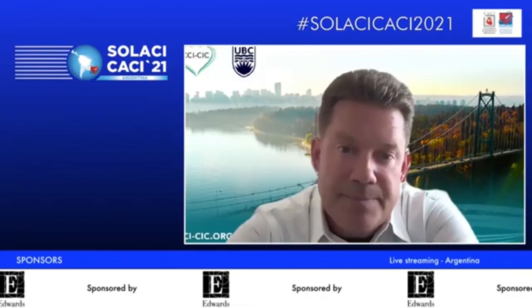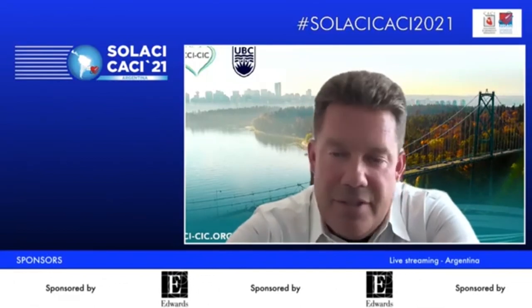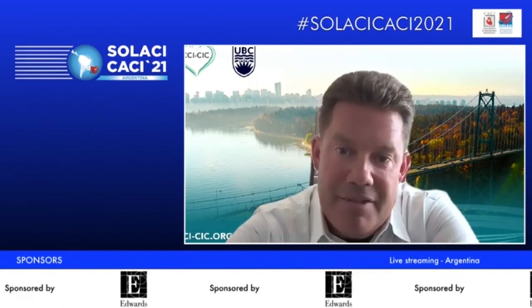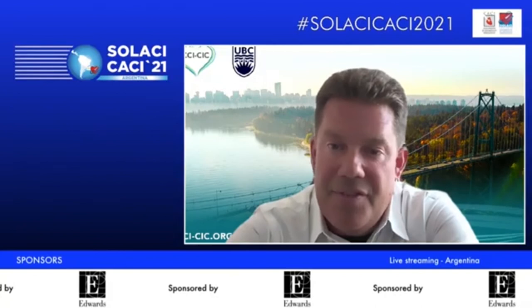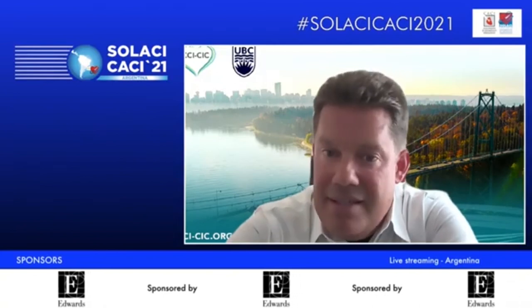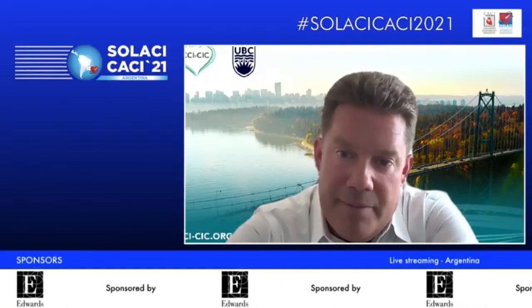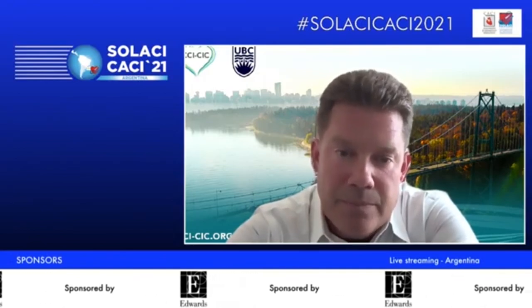And you also use the annulus, right? Yes, to measure, to size. But again, we have the luxury of having Jonathan Leipzig and Philippe Blanqui, who are part of our weekly heart team, so that's very reassuring. I think CT planning, like everything now in TAVI, is the gatekeeper, and that dictates where we're going, which platform, and how aggressive we're going to be.